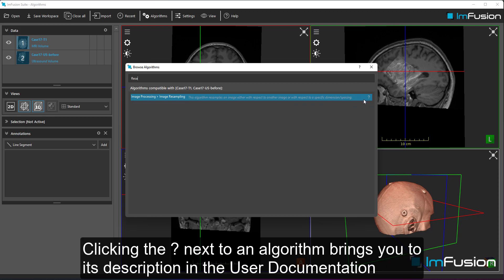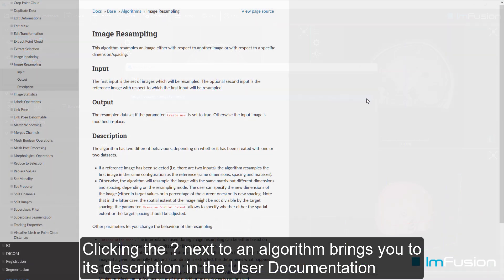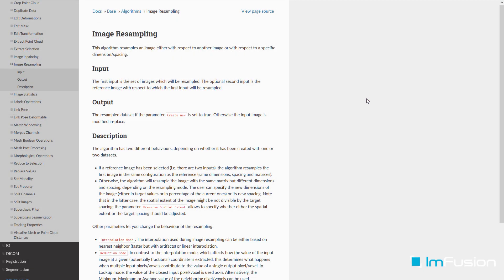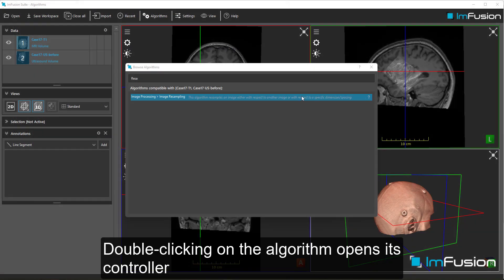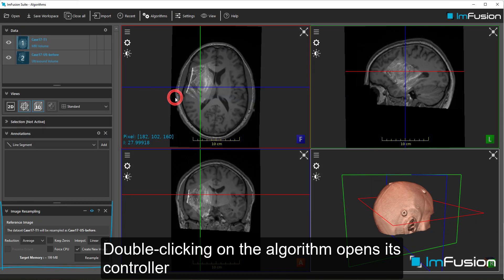Clicking the question mark next to an algorithm brings you to its description in the user documentation. Double clicking on the algorithm opens its controller.